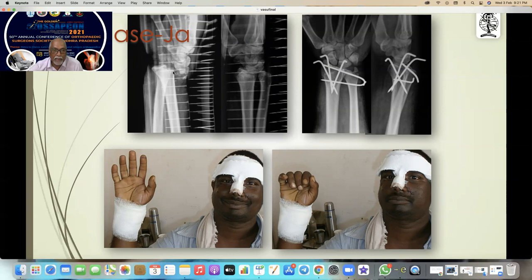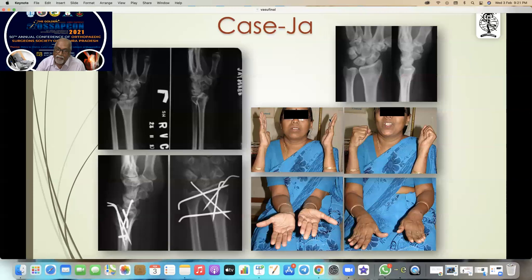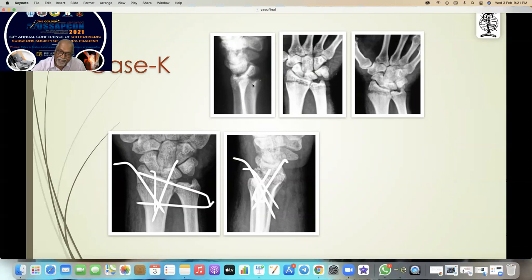This man has a dorsal lip fracture — think about any plating in this case. These are all far distal fractures, and that is the result. Think about this small fragment — you can even reduce it and put it there subarticular.